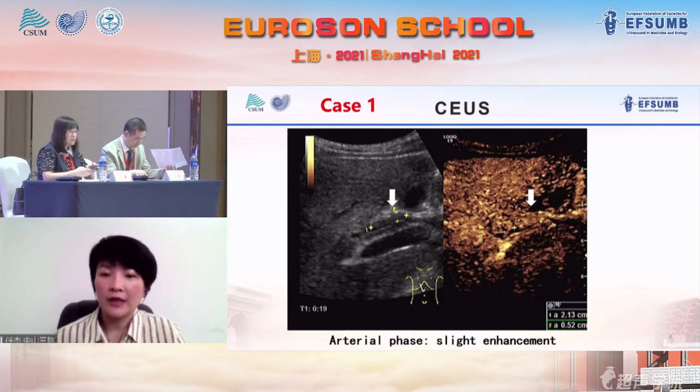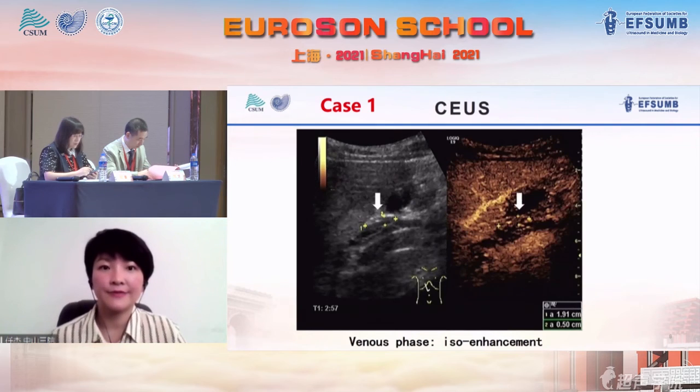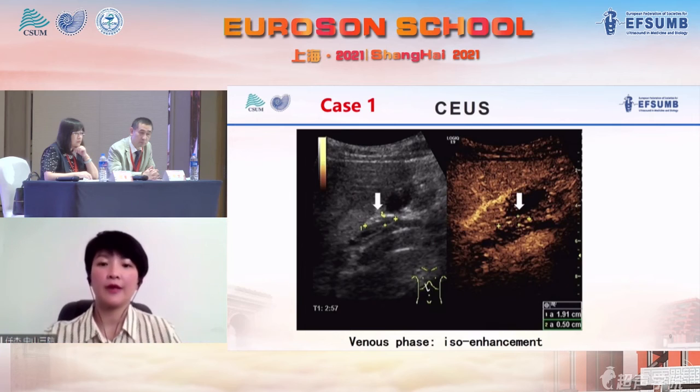Please next. In the venous phase, iso-enhancement was observed. Please next.